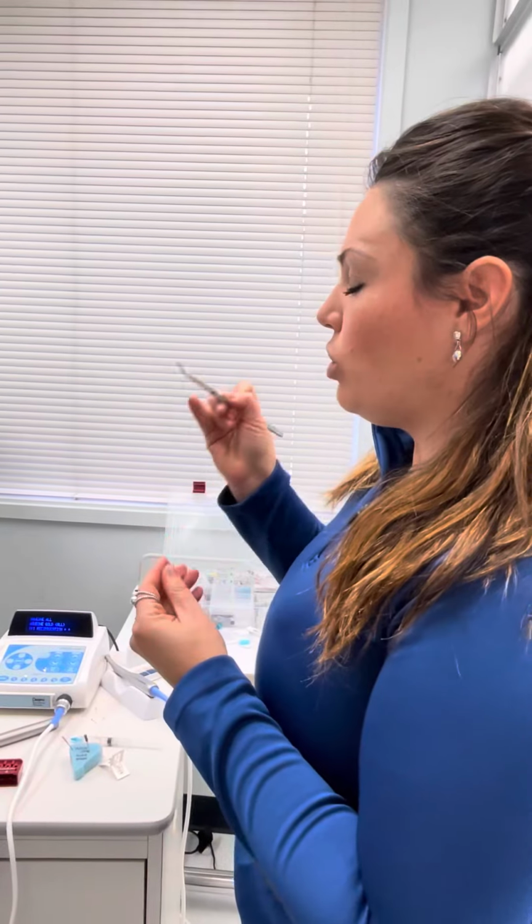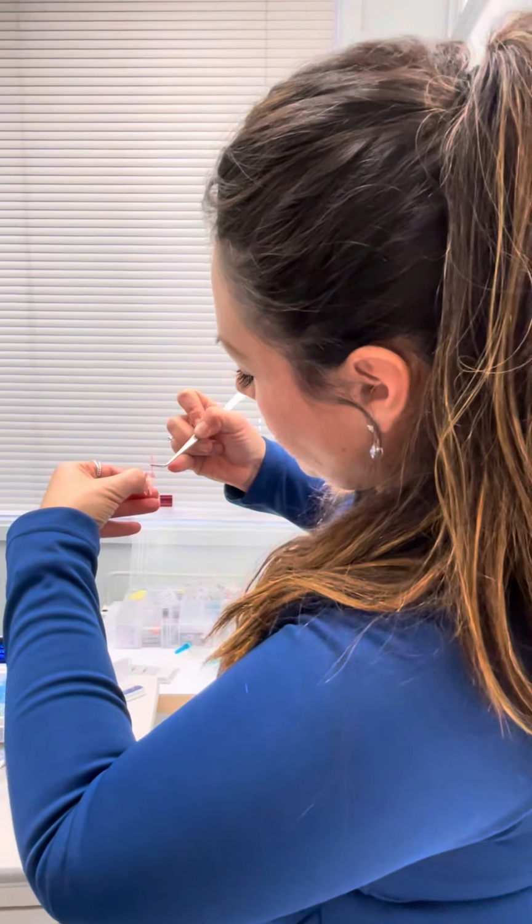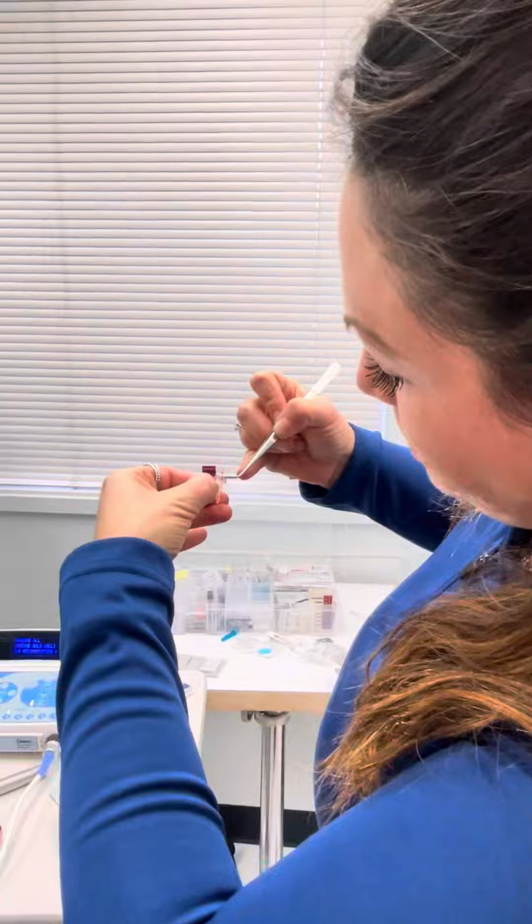When you're doing cold lateral, it is recommended to be generous with the sealer. If you're doing other obturation systems, they're recommending less sealer, because sometimes that sealer can cause a barrier between your gutta percha and the wall. So we're going to go ahead and seat our cone.